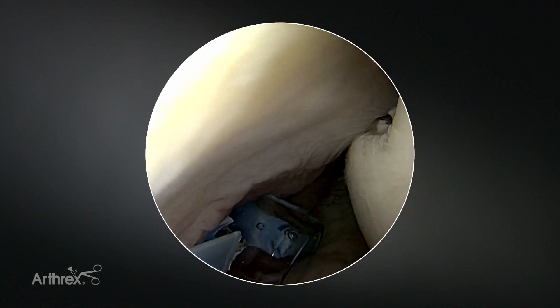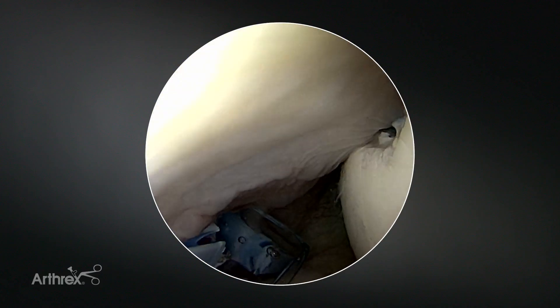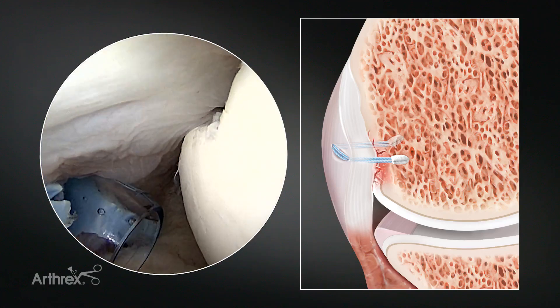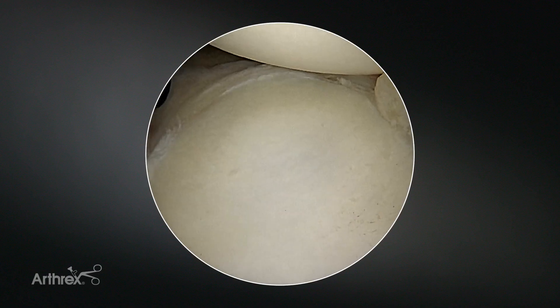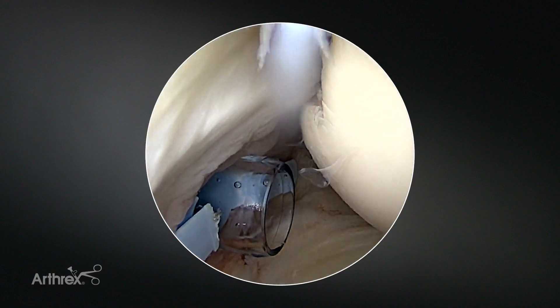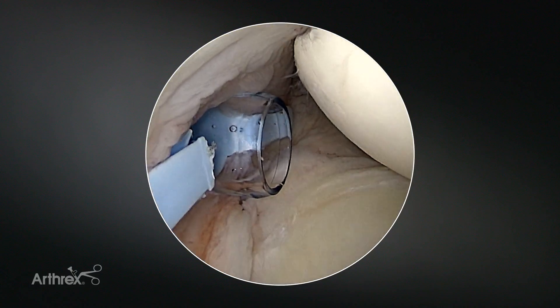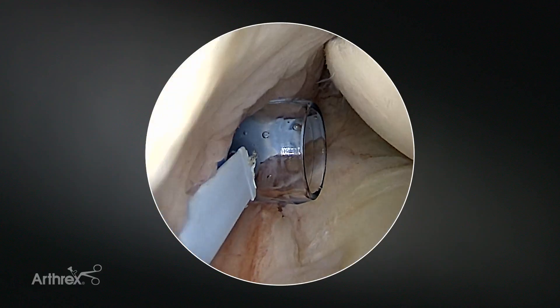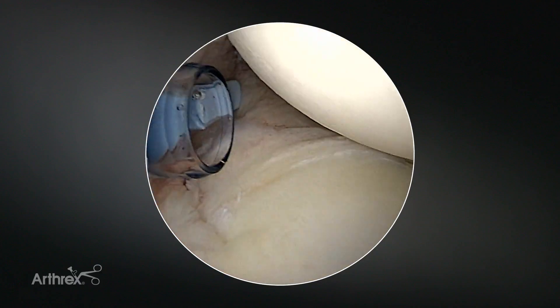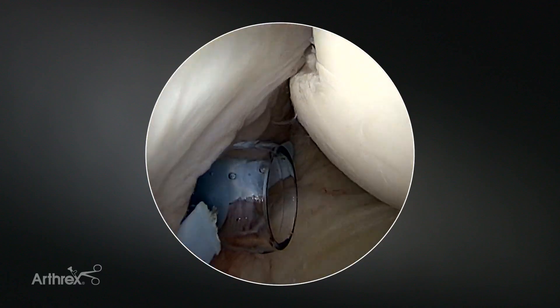Both sets of sutures are converted and we'll simultaneously go back and forth to bring that soft tissue down to the Hill-Sachs defect. Now our Hill-Sachs defect is extra-articular and the capsule is right up against that bone bed. Here's our completed Bankart Remplissage. This technique let us complete the remplissage in a very efficient manner, adding perhaps only five minutes to the case — the key steps being placement of the anchors first, followed by your Bankart repair, and then going back and tensioning the remplissage.